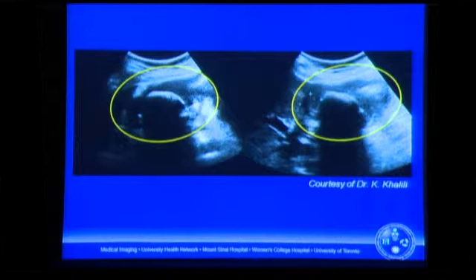It was pretty clear that she had an infective process ongoing. She had symptoms in the right upper quadrant. She was tender there. So we interpreted this as probably an inflammatory process rather than tumor, and we said it's probably acute cholecystitis. And she went back to the floor, and because of her other medical conditions, she was managed conservatively with intravenous fluids and antibiotics.